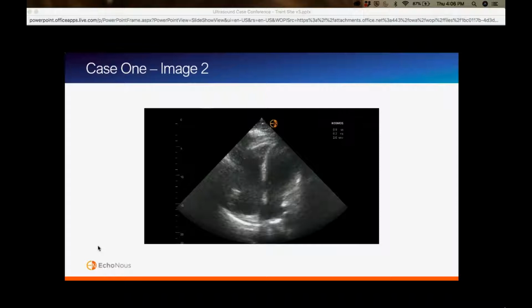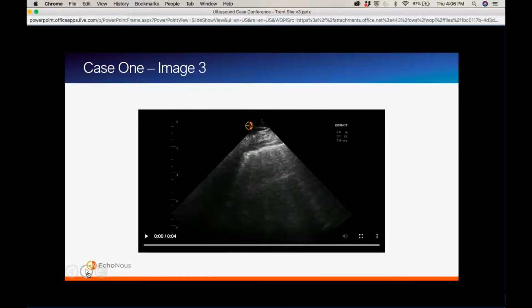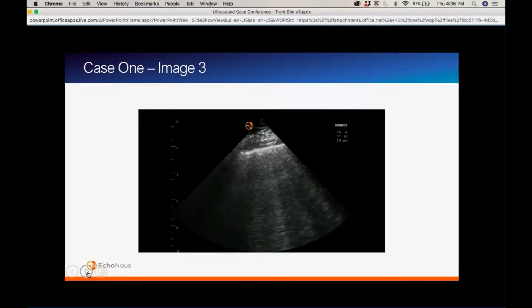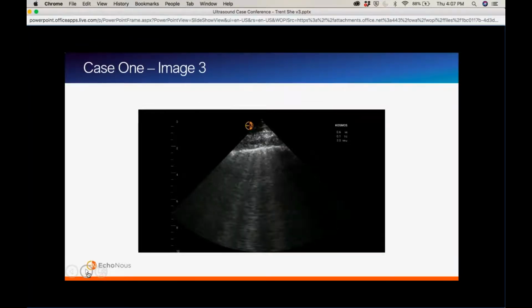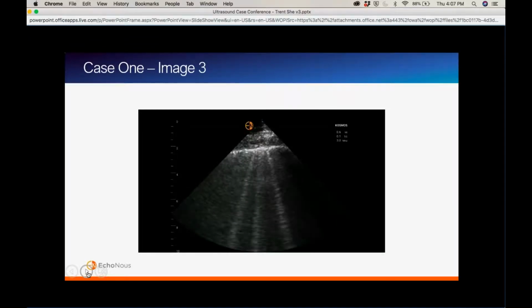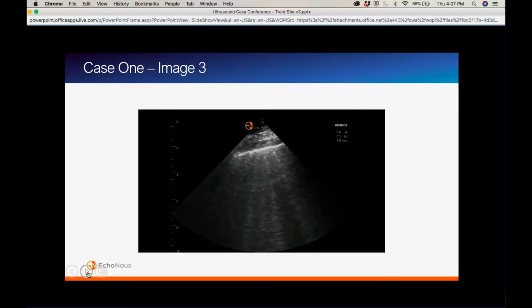So now you have this apical 4. And then what's happening with this patient now? Because now it looks like a lung ultrasound. Yeah, we moved on from the cardiac ultrasound. We saw the dilated RV and McConnell sign, theorizing that this patient's hypoxia was from pulmonary embolism. But then we moved on to a lung ultrasound, and this view is at one of the apices of our patient's lungs. But I can tell you that this view pretty much matches all of the views that we got of the lung. It was just diffusely this kind of image right here.